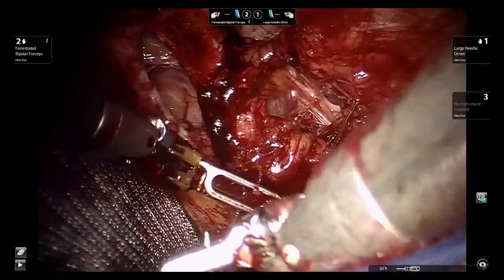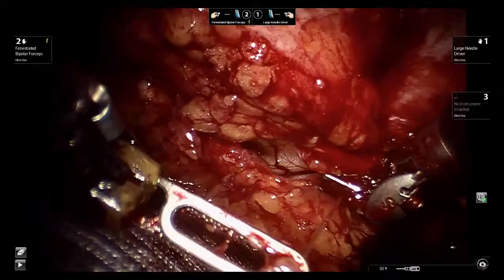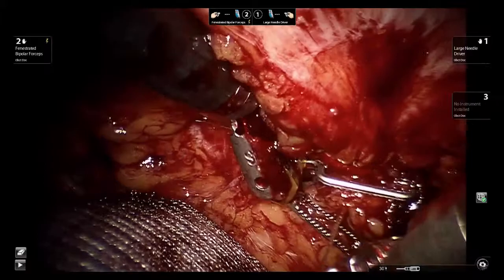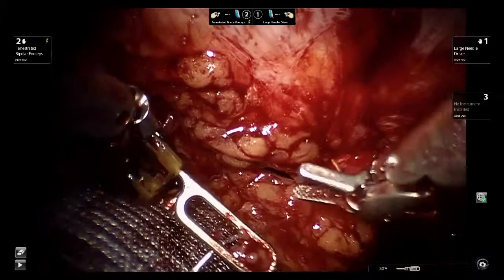The benefit of the barbed suture is as you pull it, you can bring the two edges together and keep them together even though there's some tension. One of the useful techniques for this part of the case is to drop the pressure of pneumoperitoneum to a relatively low number such as 6, thus allowing for the fascial edges to come together a little bit more easily.